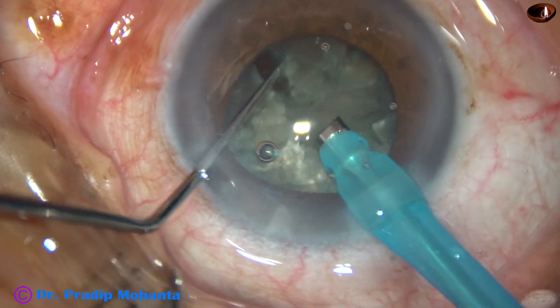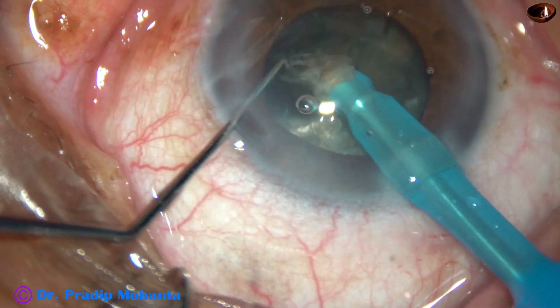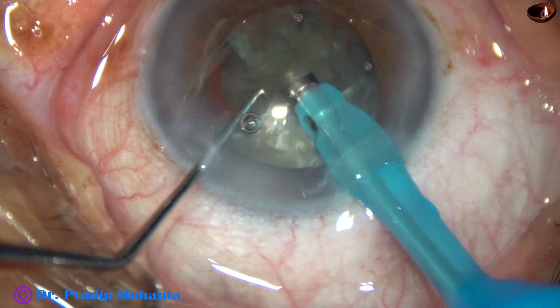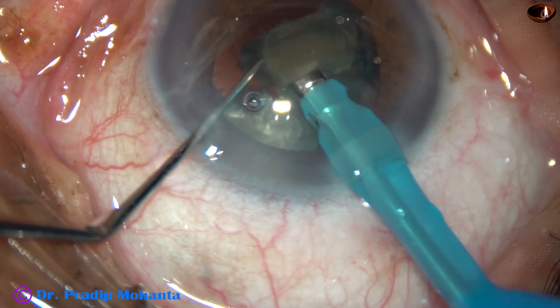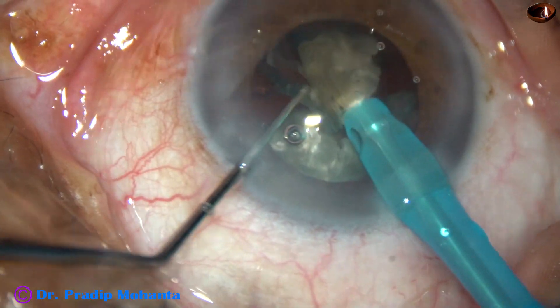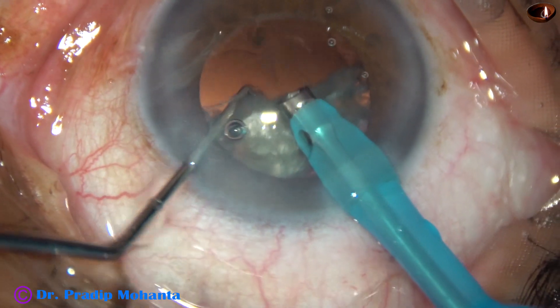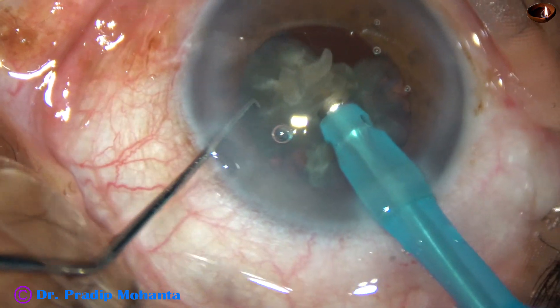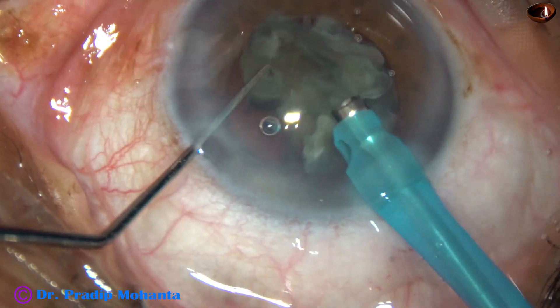Each nuclear fragment is tilted, and emulsification of each nuclear fragment is started from its apex. The idea is the sharp apex should not hit the posterior capsule. If the equatorial part presses the posterior capsule, it sits over a large area. But if the apex hits the posterior capsule, the pressure is applied on a point.